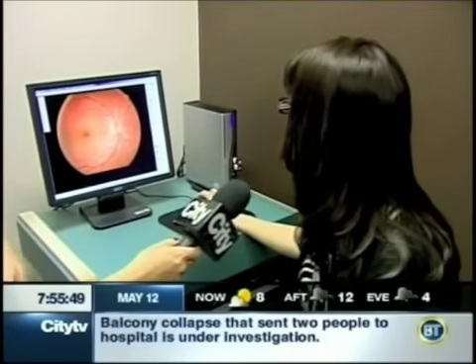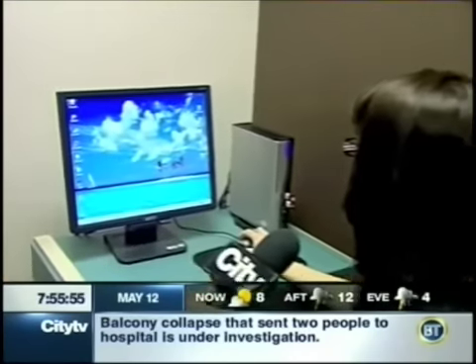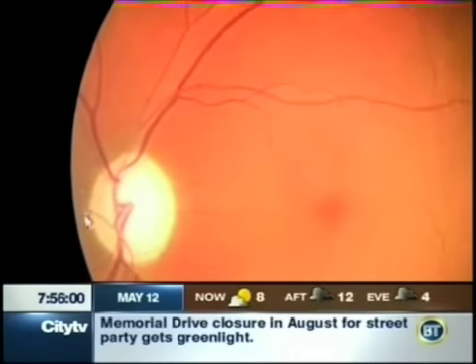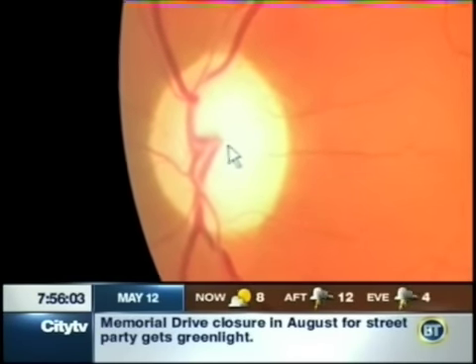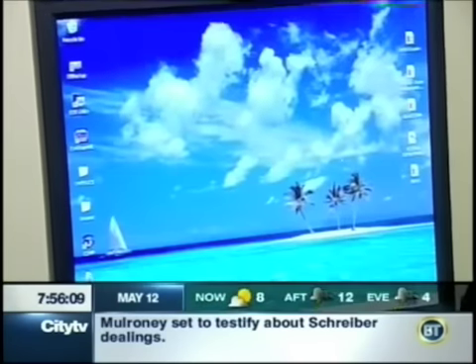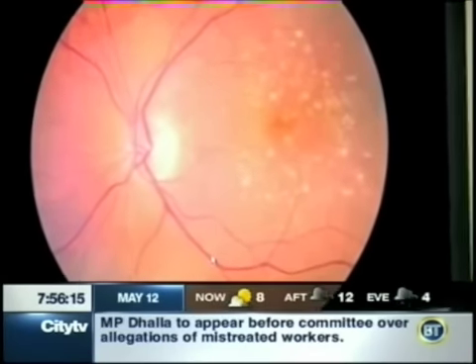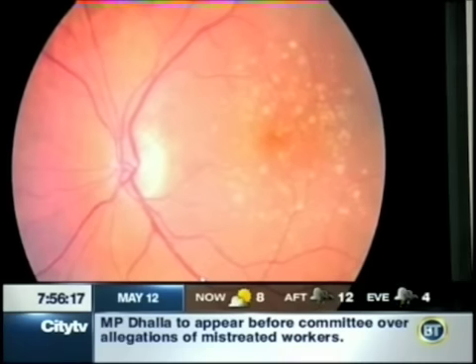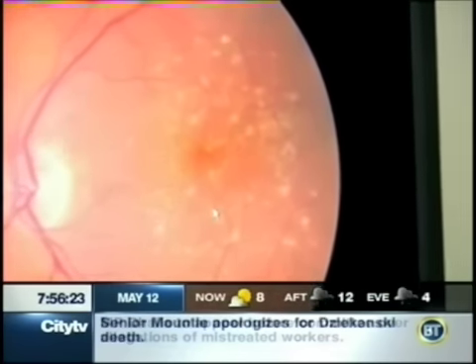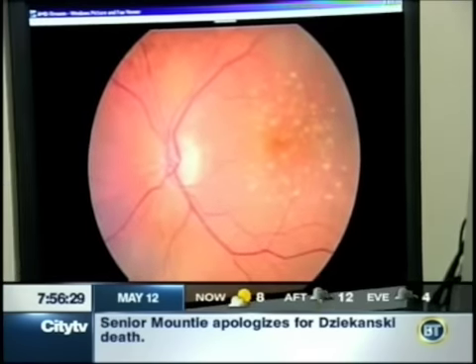So let's go through a couple really quickly. We'll go through some unhealthy eyes, and the different things that you can tell. So what is this? This here shows glaucoma. The optic nerve is very pale and almost looks like it's glowing, and it's caused by eye pressure that's too high for that individual's eye. With glaucoma, that can happen almost at any age, so that is checked right from early age general assessment when you're in for an eye exam. This is a type of macular degeneration. It's more of an age-related problem, but this is a form of dry macular degeneration.